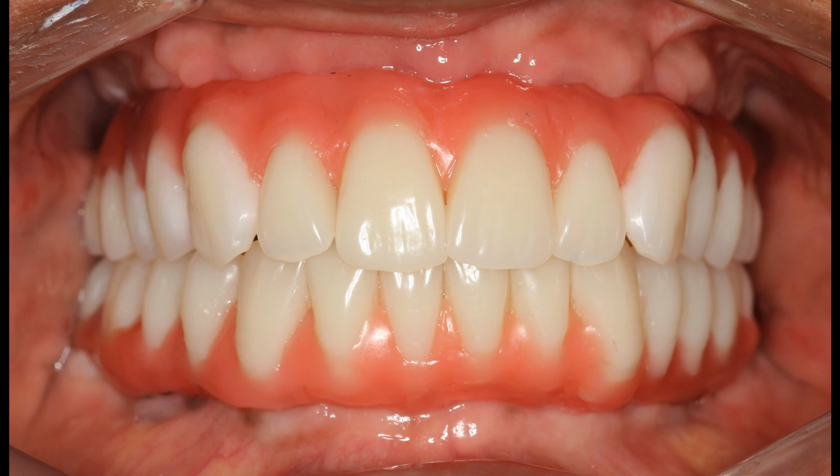Both upper and lower prototypes tried in the mouth so that he, the family, me, and my staff can all comment on how they look. During this try-in, we take probably 40 different pictures from all different angles, with lips retracted and without. The main thing we try to do is to get patients to animate fully.